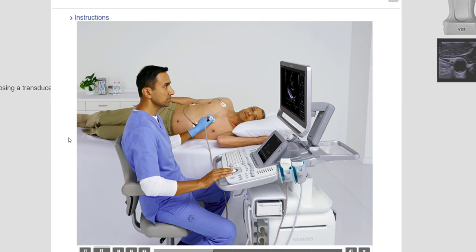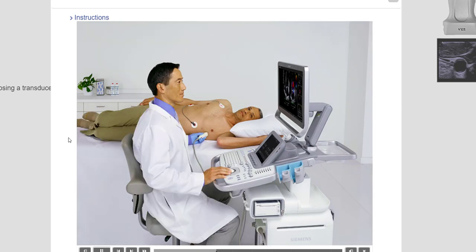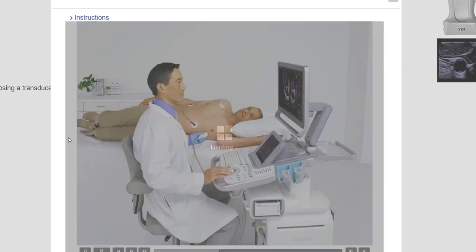In these examples, the clinician is using the phase transducer to scan between the ribs near the sternum of an adult. The FOV, shape of the housing, and small lens makes the phased array transducer the perfect choice for challenging echocardiograms. Choosing a phased array transducer for a pediatric echocardiogram can vary depending on the size of the child and if the child has complex congenital heart disease.